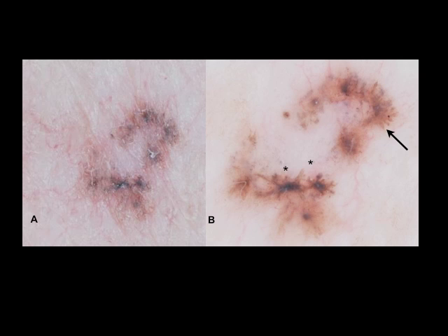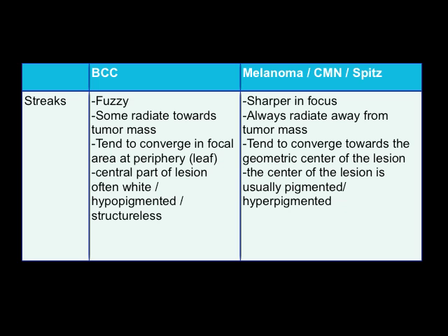Here is a basal cell carcinoma revealing structures that resemble streaks at the periphery, highlighted by the black arrow. In addition, this lesion has streaks present towards the inner part of the tumor. Note that the streak-like structures marked by the asterisk are radiating towards the tumor itself — a feature not seen in true streaks encountered in melanocytic lesions. In basal cell carcinoma, the streaks tend to be fuzzy and out of focus, some radiating towards the tumor mass, and they tend to converge towards a focal area at the periphery creating the so-called leaf-like structure. The geometric central portion of the lesion is often white or hypopigmented and structureless.